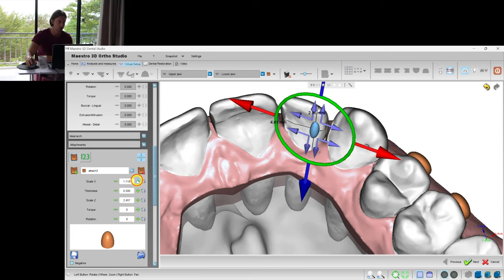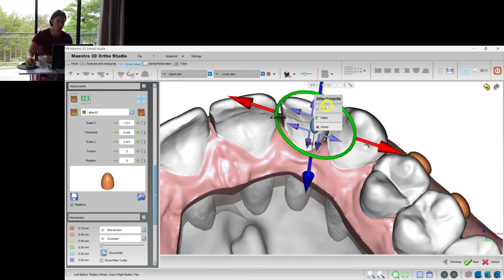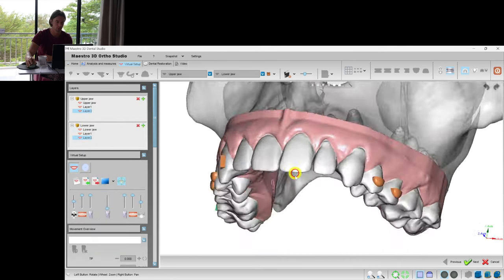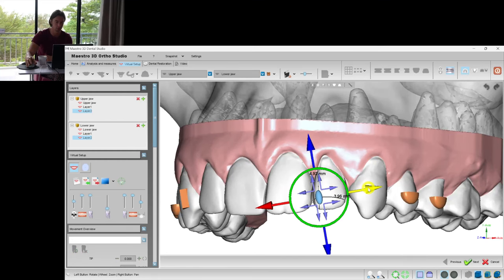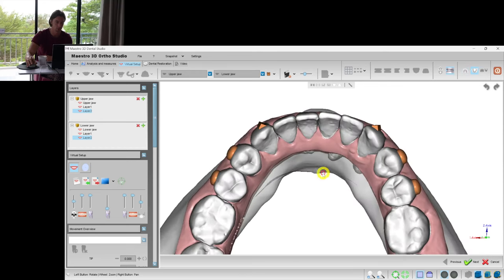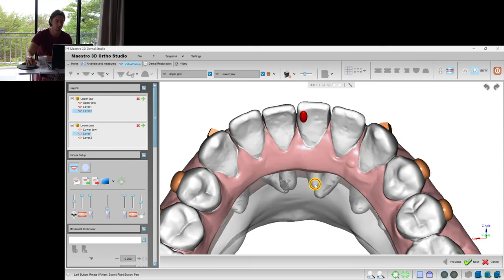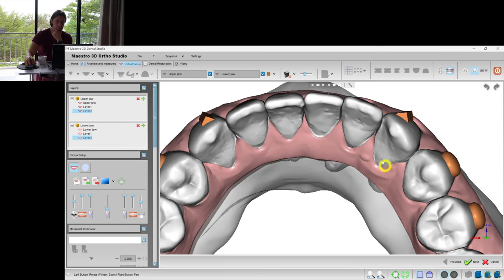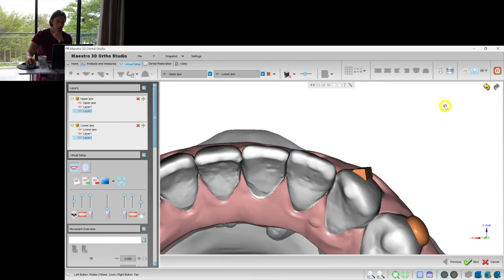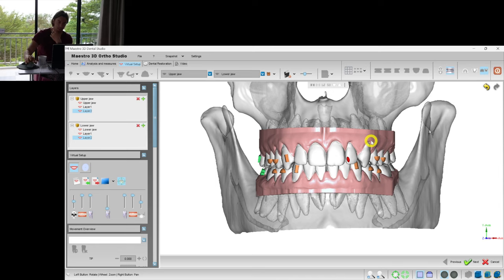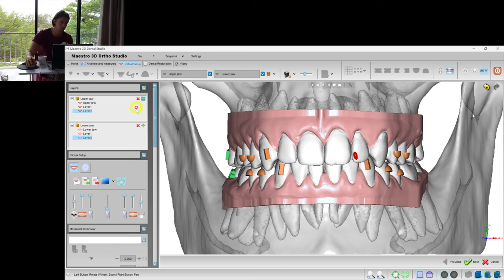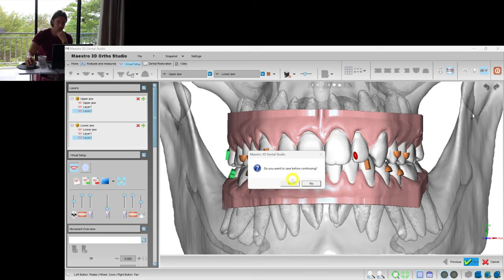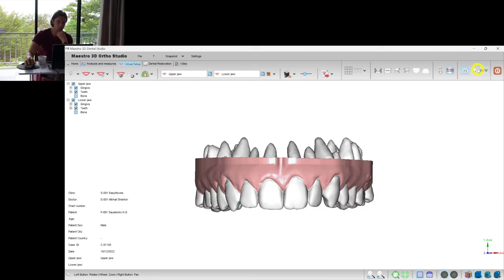And let's add some negative attachment, this shape, this size. It turns red. And layer 2, we put the attachment of the mesial part. Do we need those attachments on layer 1? I think here it might help. It will need some additional overcorrection when the patient is done with the initial set of trays. We can just go back to this virtual setup, create a new layer, add some overcorrection, and print one or two more aligners.